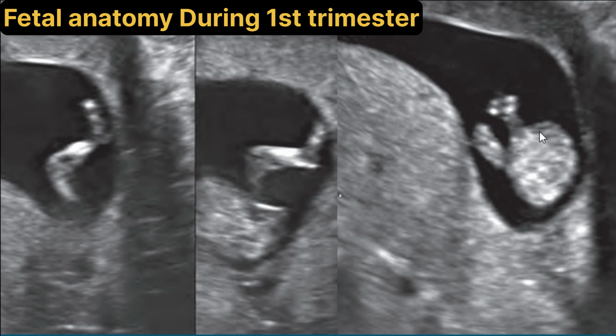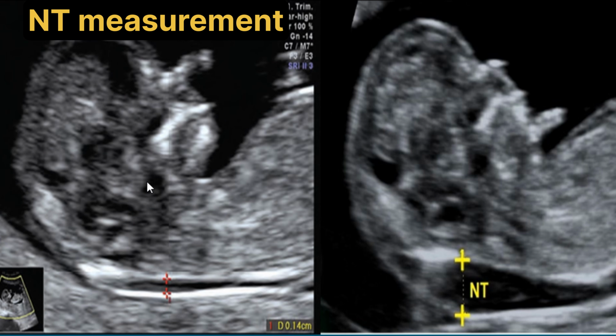Now this is another transverse image of the fetus through the transabdominal region, and here we can see this one is the abdomen of the fetus, and in the sonogram it is clearly visualized the abdominal cord insertion of the fetus. Now we are going to discuss one of the most important parameters that is measured between 11 to 13 weeks of the fetus, which is Nuchal translucency measurement.